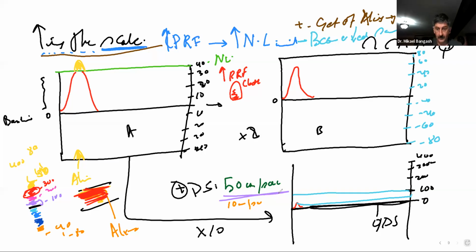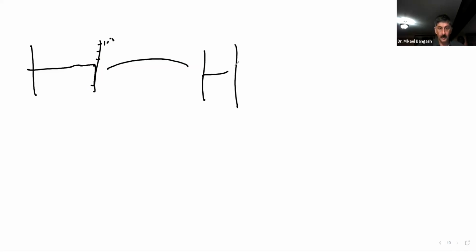Clear? Okay. Because the numbers that you have, as you increase your PRF, or what we mean is, as you increase the scale, you will see that first these numbers may go by tens, then they may be counted by hundreds, and so on.